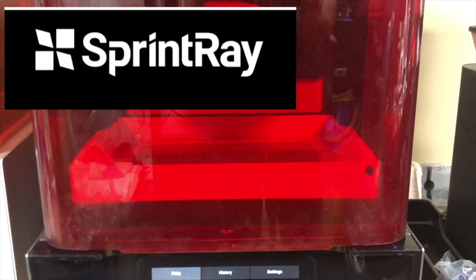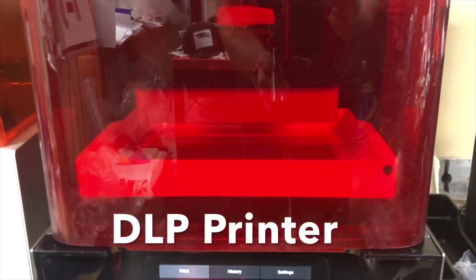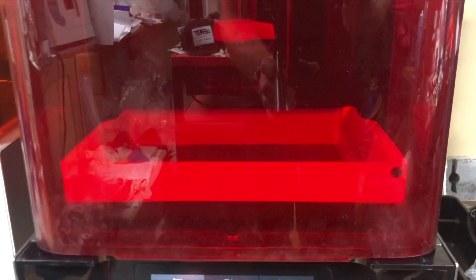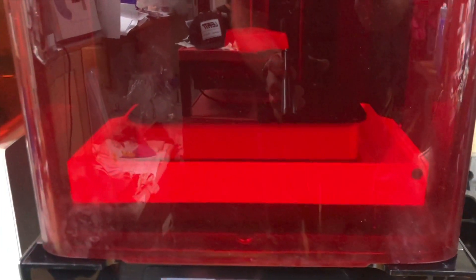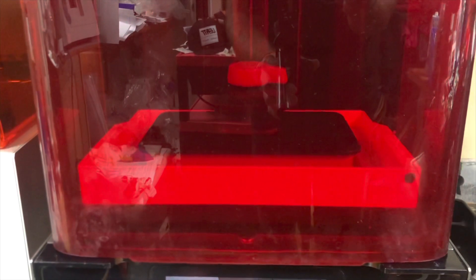We want to use a high-accuracy print on this particular case. As the platform comes down and dips into the resin, it's going to start to do the DLP printing, which is digital light projection printing.